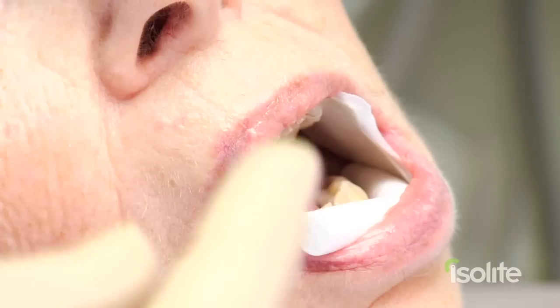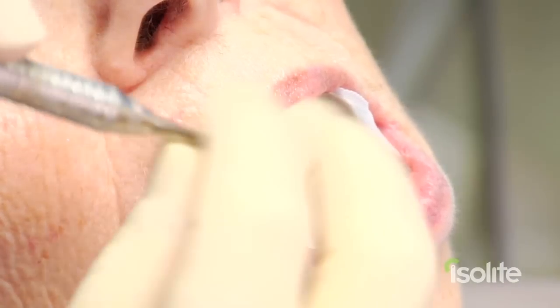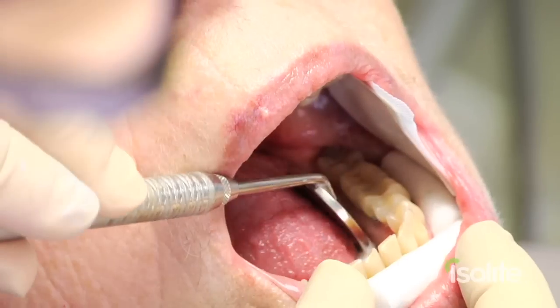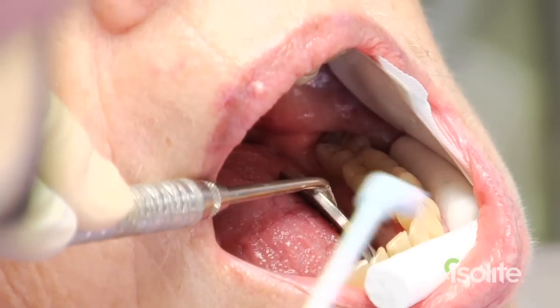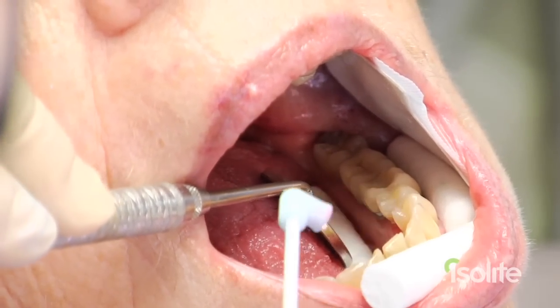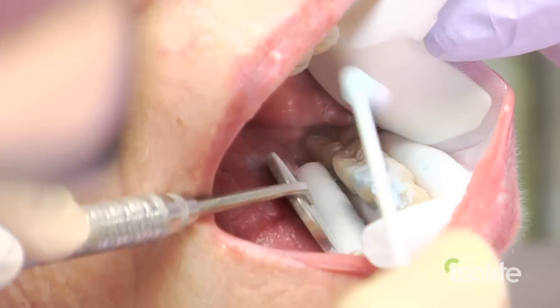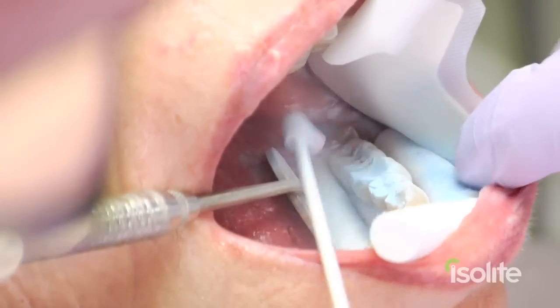As you can see now, number one, I have to be worried about keeping her tongue out of the way, so now I've got to retract her tongue — a little bit more work for me. I've got to spray the image. It's mandatory that my assistant is in there now, and I'm fighting this right now to try and get a good image.